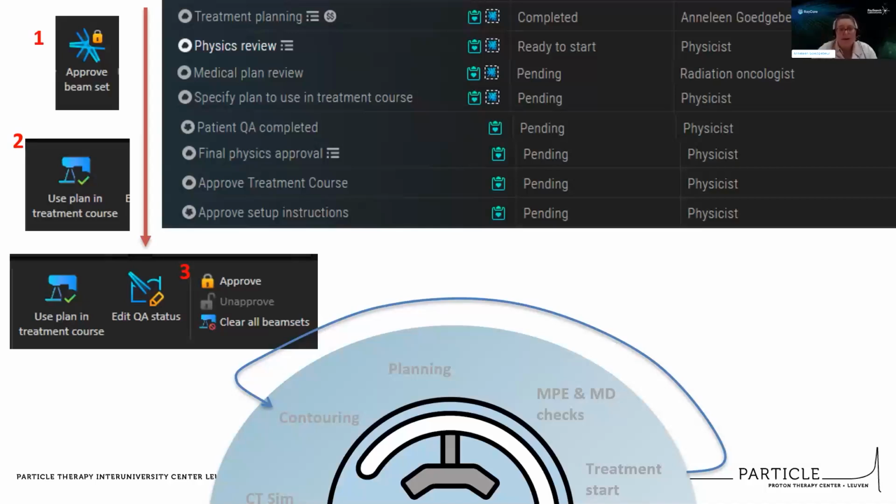So that's also a possibility where you can use the same sequence. In my feeling, the granularity of the sequence of RayStation approval tasks linked with RayCare tasks gives us safety. And additionally, we keep the same order of tasks as our initial planning. So in a way that gives us efficiency as well, since this one sequence fits most of our scenarios, makes us not have to reinvent the wheel there, and makes us agile for any change of circumstance within our patients.